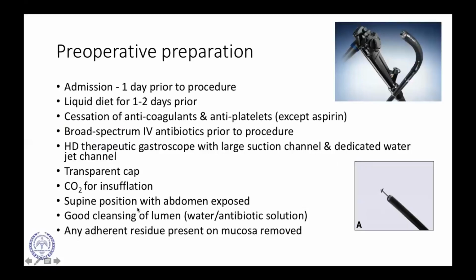Preoperative preparation would include admitting the patient a day prior, administering a liquid diet for 1 to 2 days, and cessation of anticoagulants and antiplatelets as per the current guidelines. Broad spectrum IV antibiotics are given before the procedure.